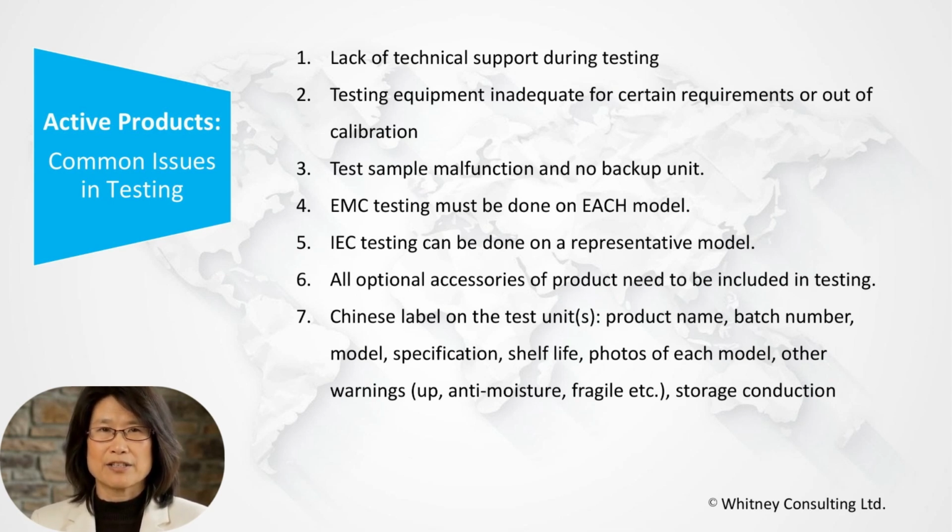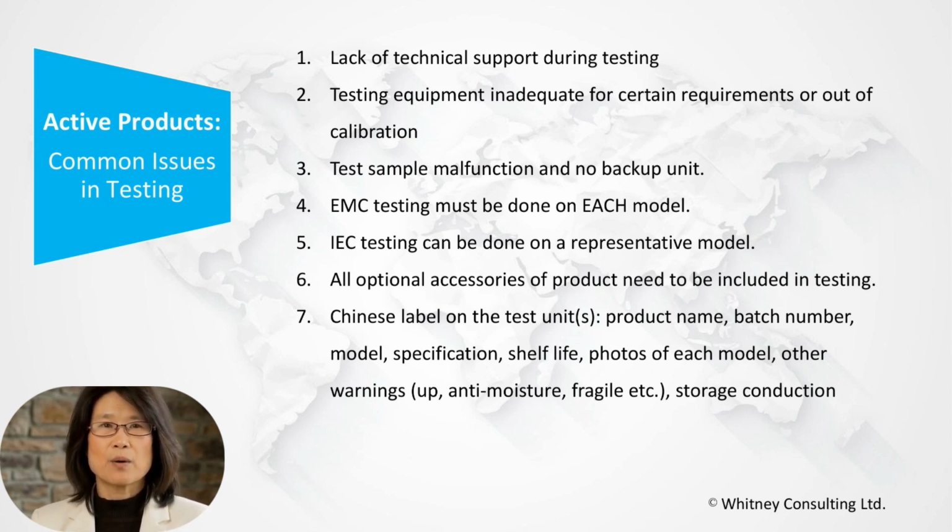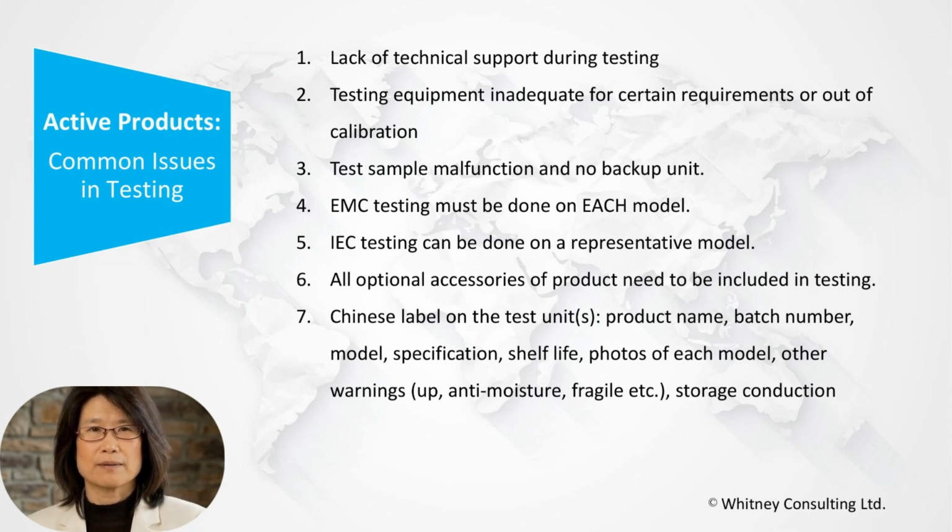Having a backup test unit is always a good idea. And also make sure that all optional accessories are available at testing. And if there are several models in one submission, be aware that EMC has to be done in all models, but for IEC, testing can be done on one representative model.